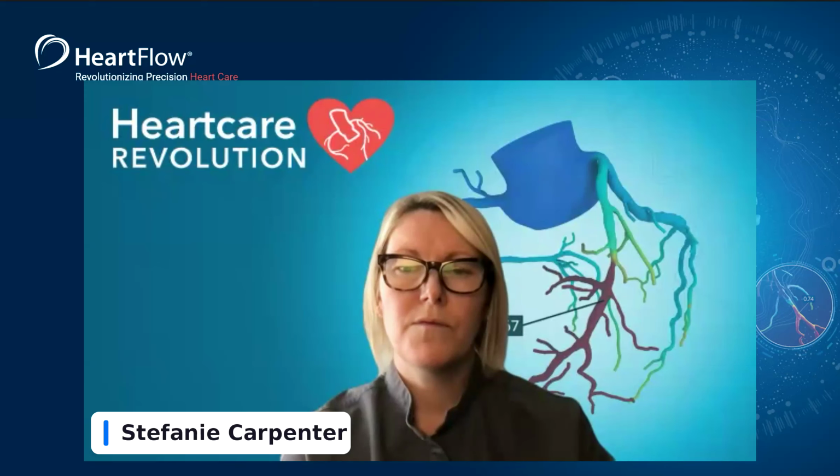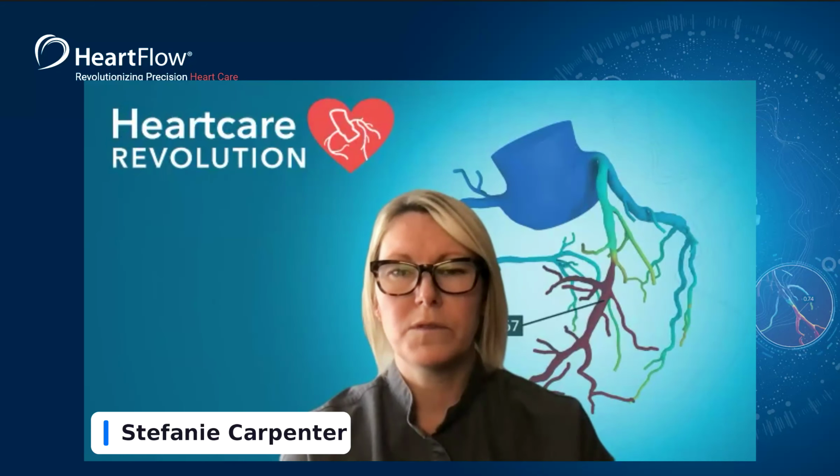Awesome. So obviously people are pulling a lot of information off of the scanner. Should they just send kind of everything that they have to HeartFlow, or just those few? How do they think about that, just on a standard patient? So typically 40 to 80% is a good range. They could also potentially, for milliseconds, if it's arrhythmic, like 200 to 400 milliseconds, or 250 to 450. Those are typically good ranges to send.